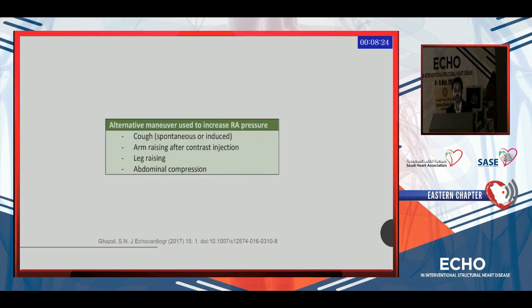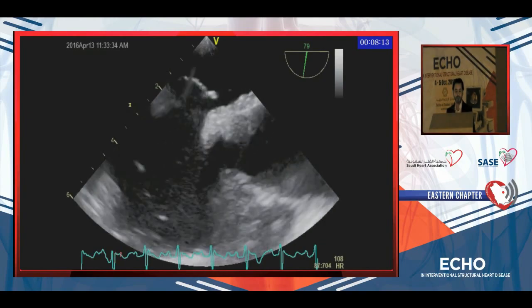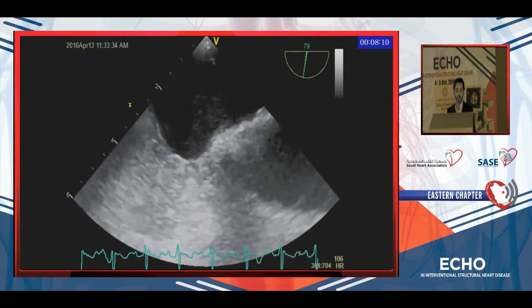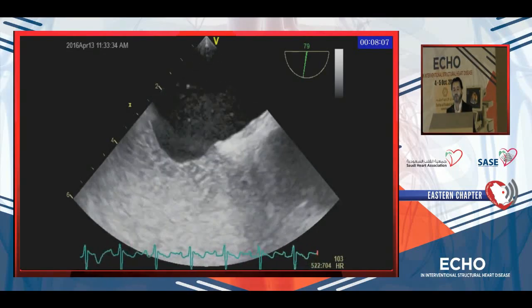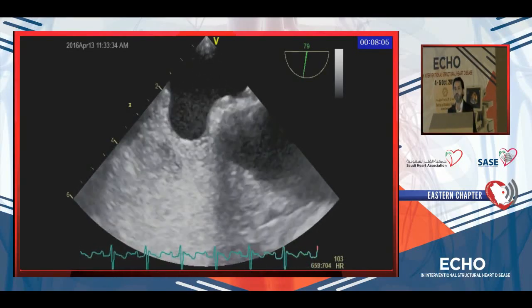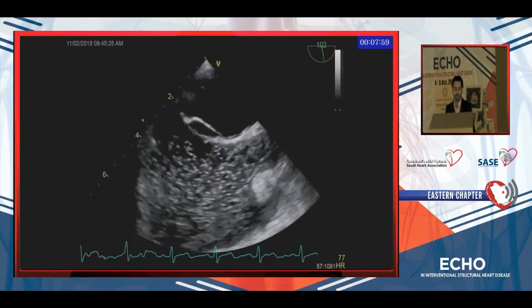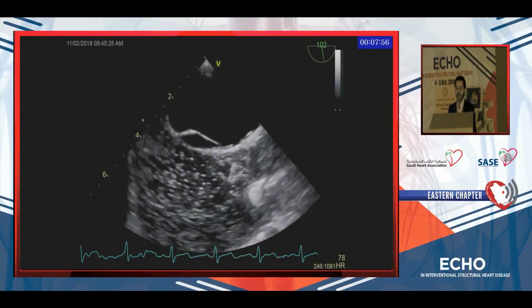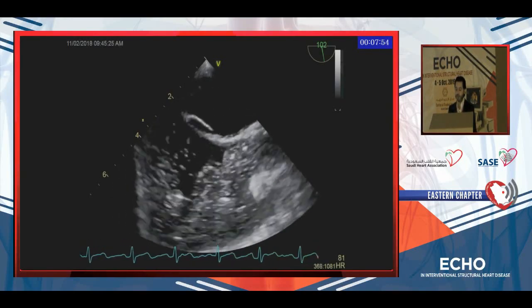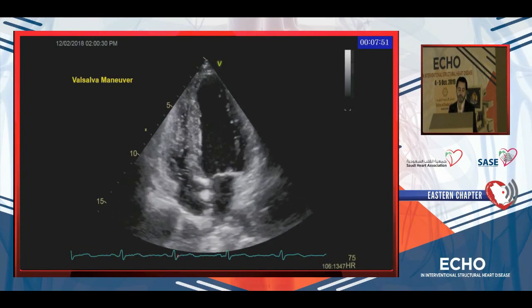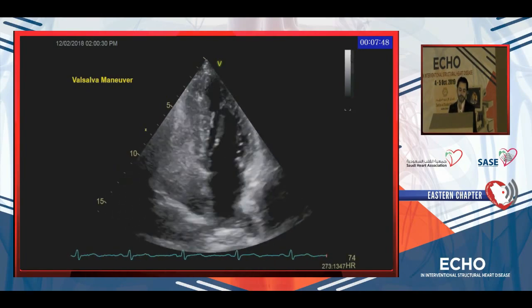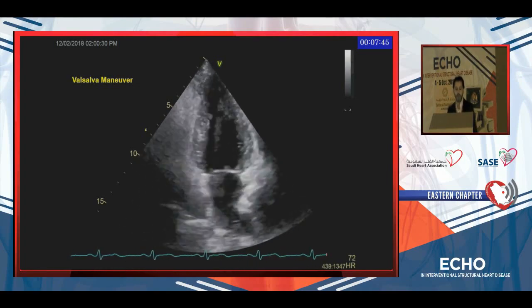Alternative maneuvers include asking the patient to cough spontaneously, inducing cough, arm raising, leg raising, or abdominal compression — especially in transthoracic echo. This is an example of a bubble appearing after five beats, passing between the thick membrane and the thin mobile septum primum. Sometimes you have inadequate injections — you should not comment on those; you have to repeat the study. This is the same patient with an adequate injection and good Valsalva, and it is positive for PFO.